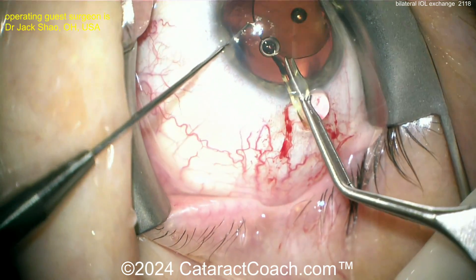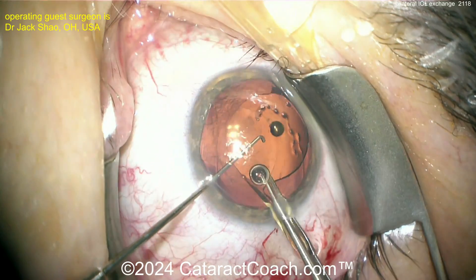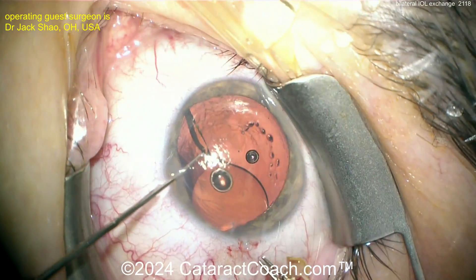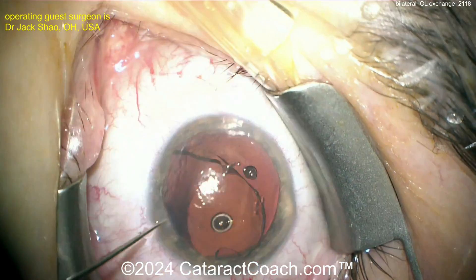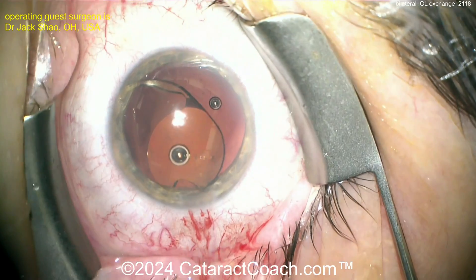The question is: will the patient complain in the post-op period? Yes, image quality will be better, and the patient will say they're happy. Aim for plano with these monofocals going in next. But look — the haptic broke off. That's an interesting one. If a haptic breaks, you have to do the twisting-out technique; you can't just yank it out.